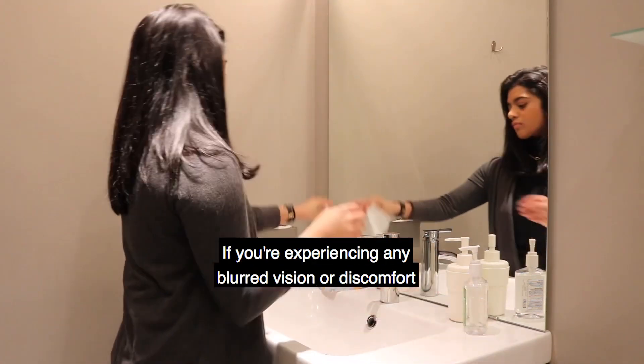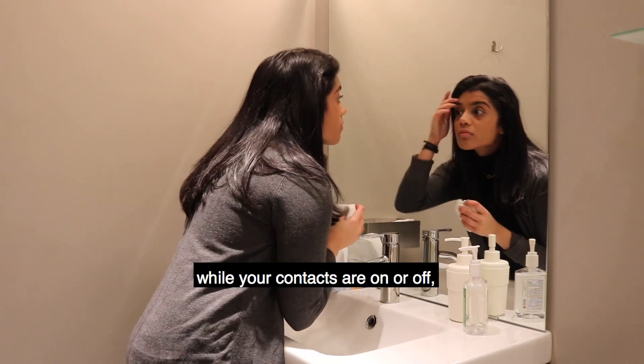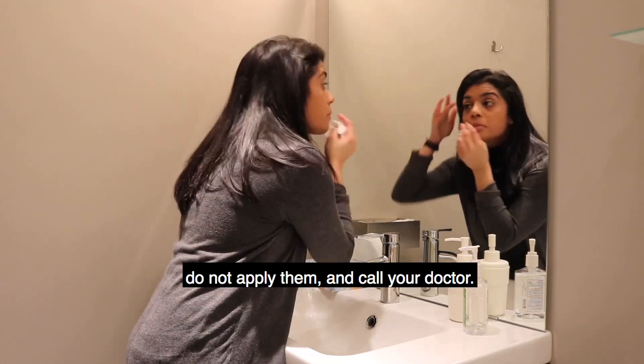If you're experiencing any blurred vision or discomfort while your contacts are on or off, do not apply them and call your doctor.